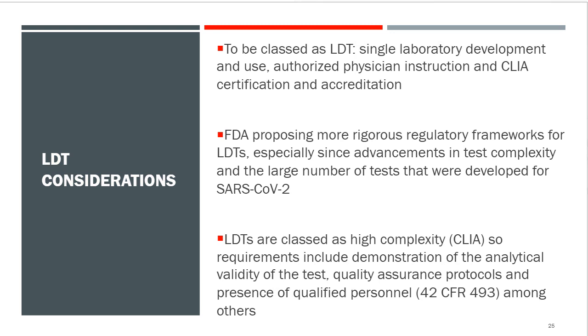The laboratory tests are classified as high complexity by CLIA. So the requirements include demonstration of the analytical validity of the test, quality assurance protocols, and presence of qualified personnel. All of the elements that we saw earlier in the CLSI quality management systems document, the quality system essentials, the QSEs, a dozen of them. FDA will want to see all of those elements satisfied.